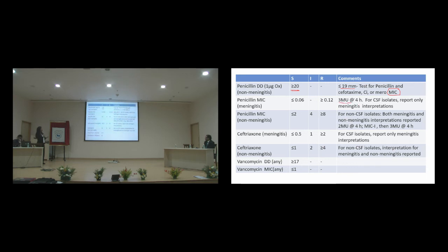For CSF isolate, report only the meningitis interpretation. Based on only meningitis breakpoints, you have to report for meningitis isolate. For non-meningitis isolates, the breakpoint is less than or equal to 2 for penicillin. More than or equal to 8 is resistant. For non-CSF isolate, both meningitis and non-meningitis interpretation has to be added in the clinical reporting.